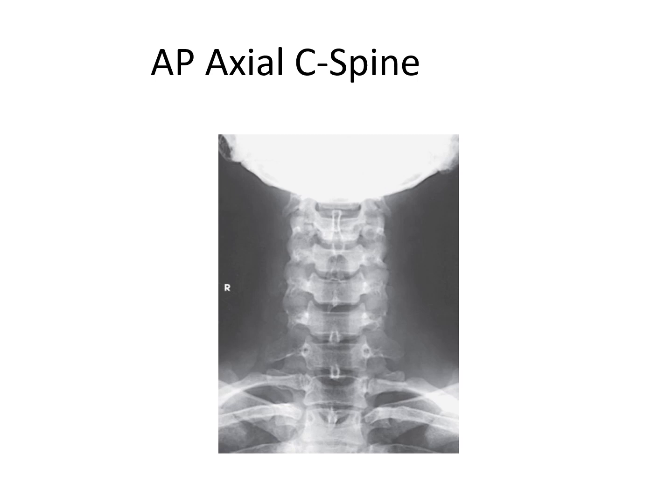There's also spinous processes, right? And those are kind of offset to the vertebrae. They project a little bit low to the vertebral body that they correspond to. But you can see them right there in the middle, and they're centered to the vertebral bodies, which is a radiographic sign for no rotation, okay? Now, how many cervical vertebrae will you actually capture here? You're only going to capture C7 to C3 if you're lucky, okay?